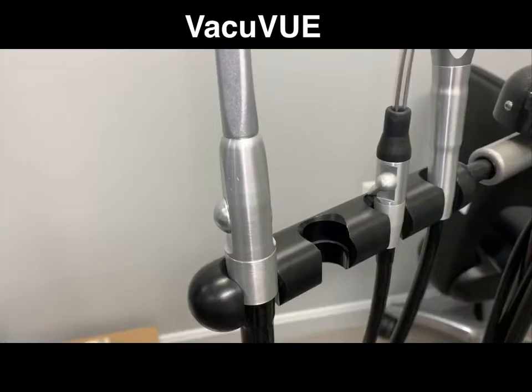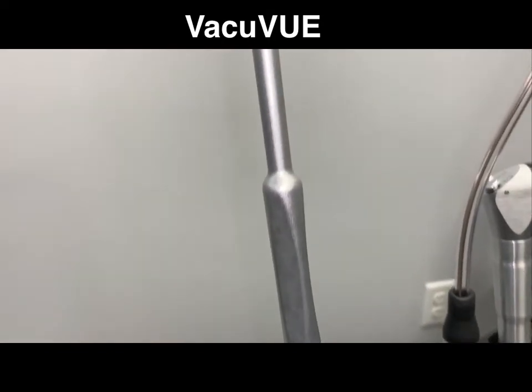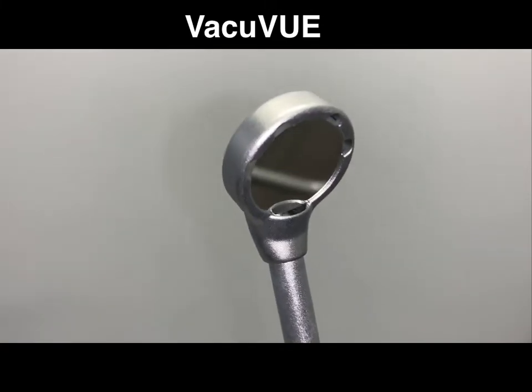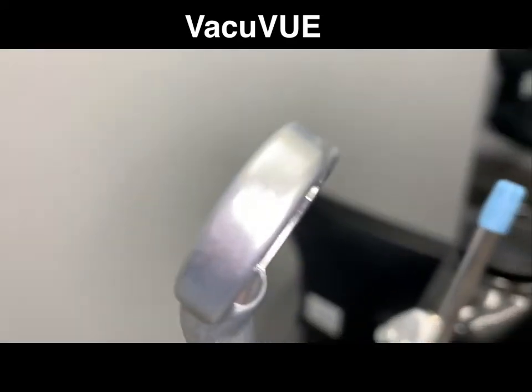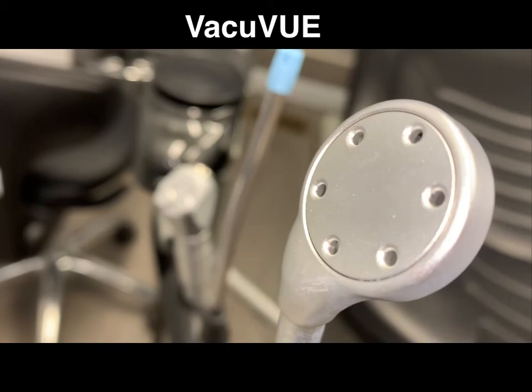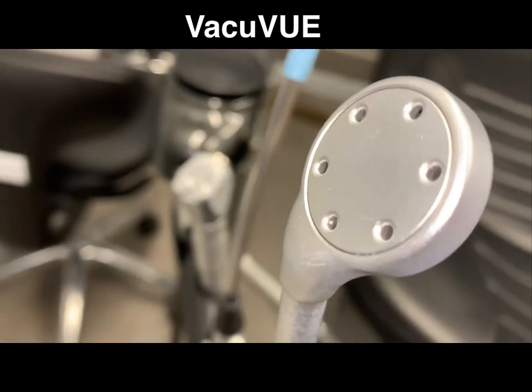All right. Now this is the VacuVUE. I have it attached directly to the HVE valve, which is not the most comfortable way to use it. They do sell a lighter tubing, and I'll show that to you in a second. These HVE valves, you'll see on the next one too, don't have holes on the edge. They only have holes in the back and holes on the face. But the holes on the face make a big difference.